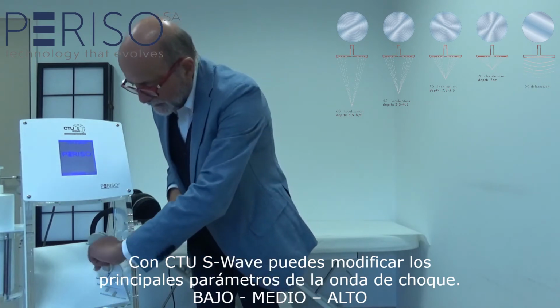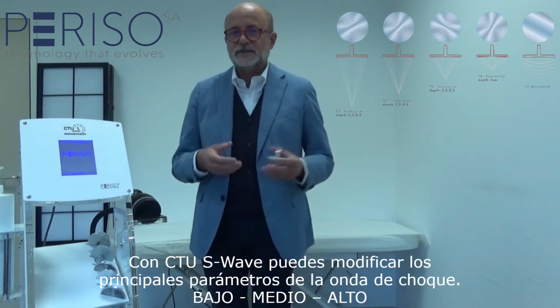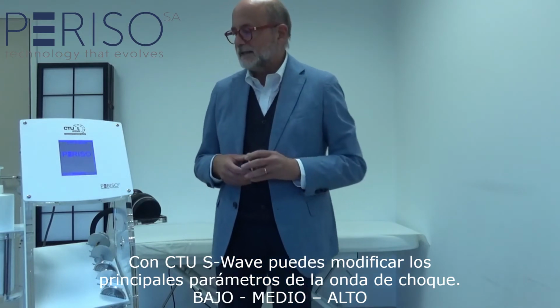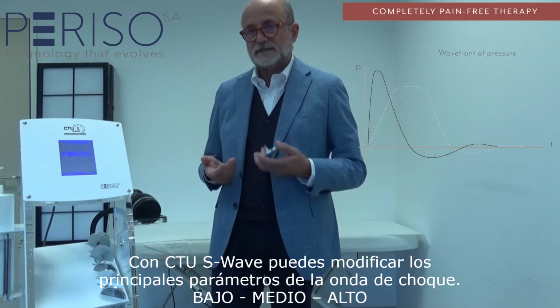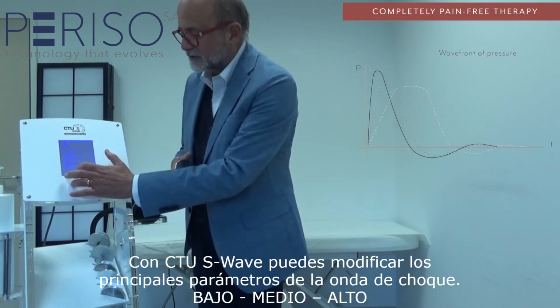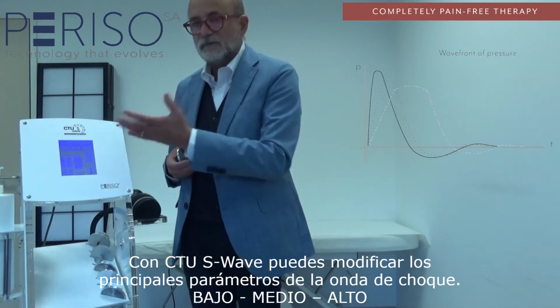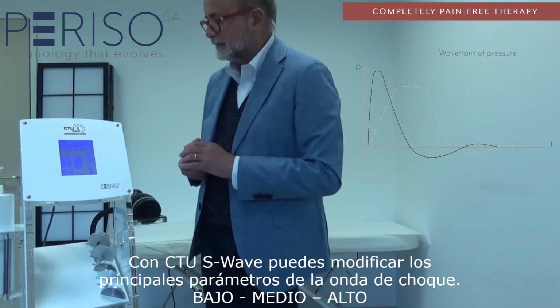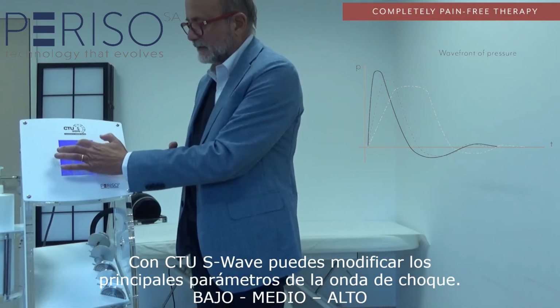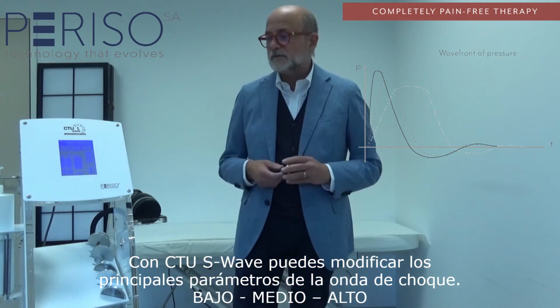Then the functioning of the machine includes the possibility to vary the main parameters of the shock waves. So I prepare the machine for the treatment, and as you can see on the screen, I can change the rise time of the shock waves.